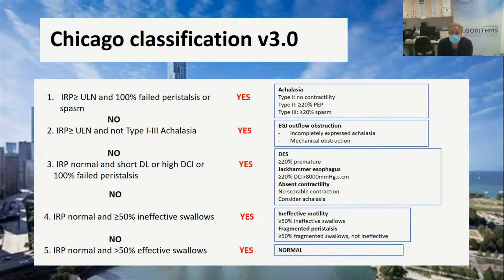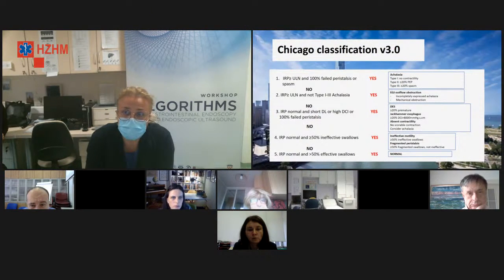Ono što je isto bitno je kalibracija samog katetera prije izvođenja pretrage, koja se sastoji od toga da se kateter potopi kroz 2 do 5 minuta na sobnoj temperaturi, nekakvoj idealnoj varijanti, u 2 ml vode, tako da ne bude ni previše ni premalo tekućine, da senzori jednostavno budu pokriveni. Sama kalibracija se vidi na ekranu i kad je kateter spreman, onda se pristupi samom postavljanju.